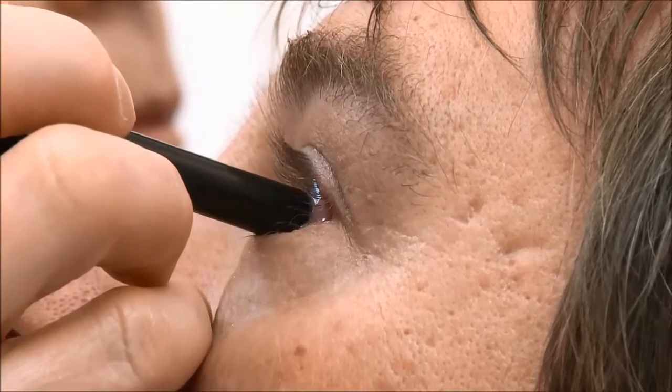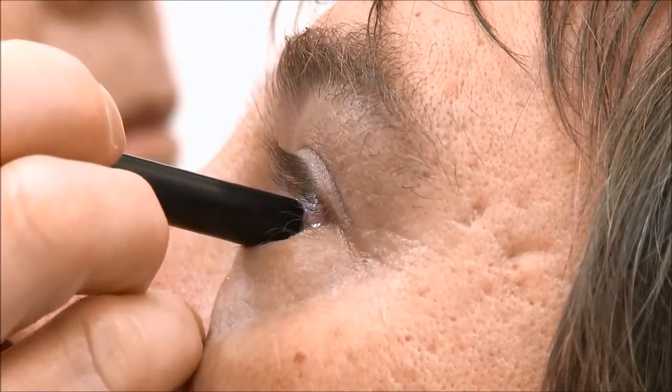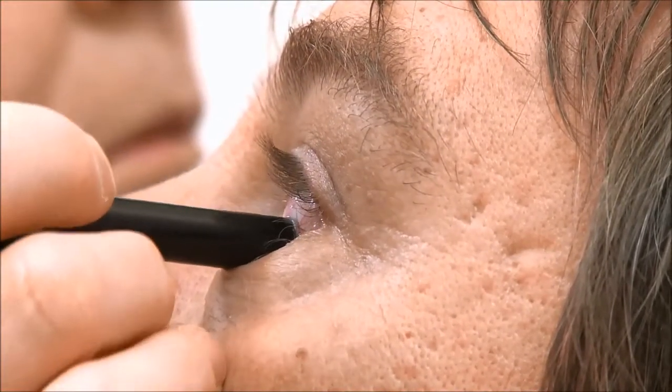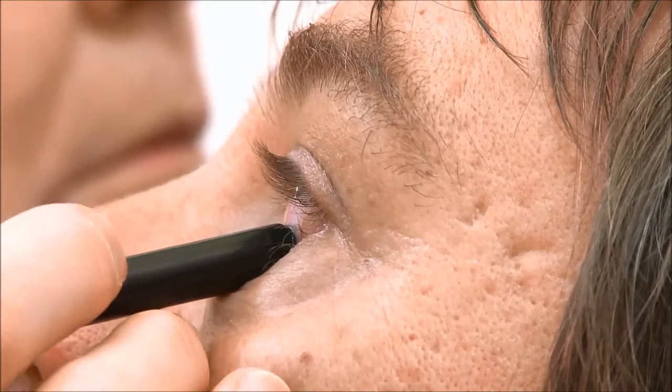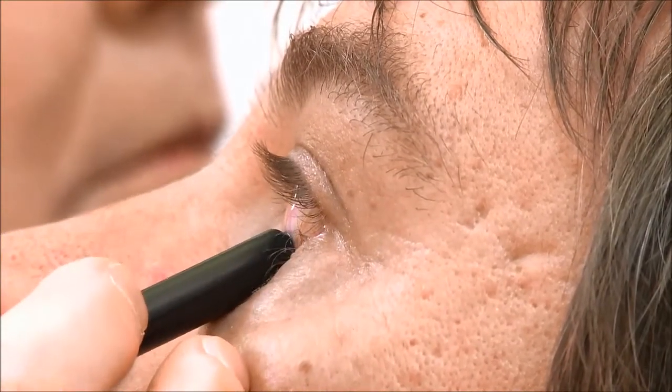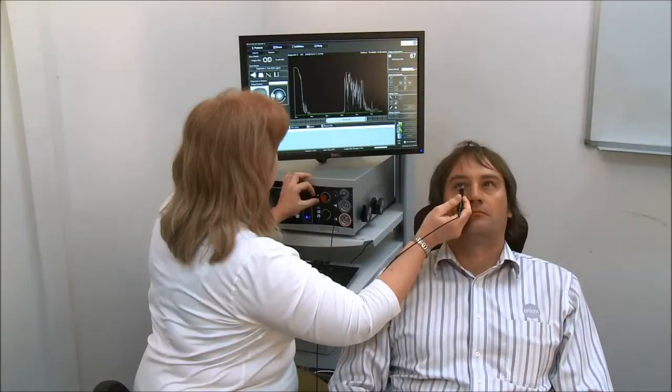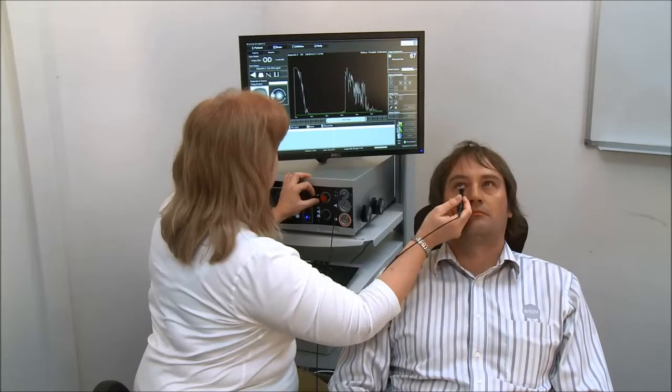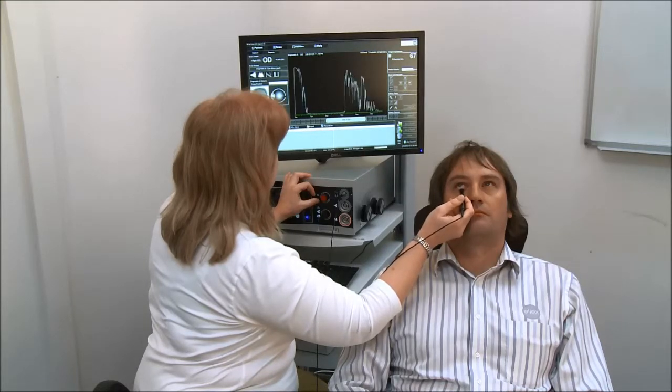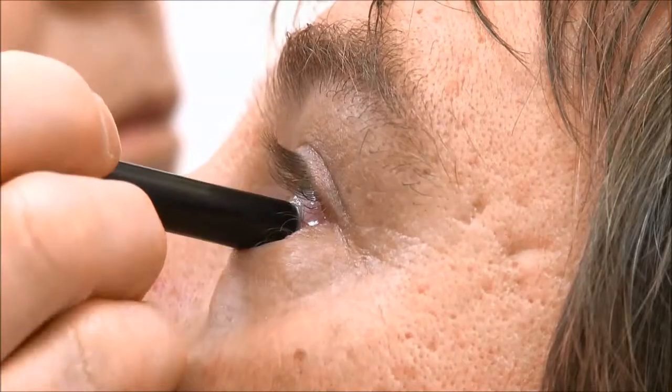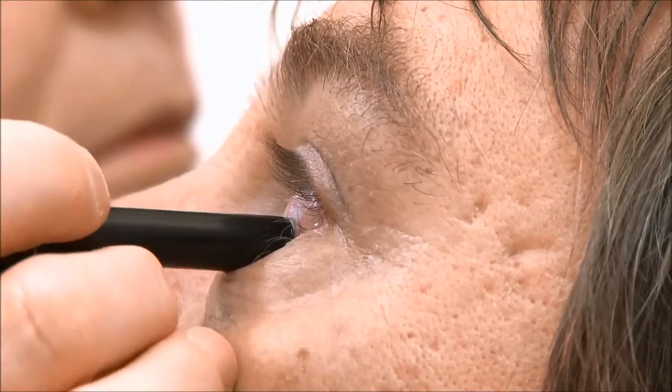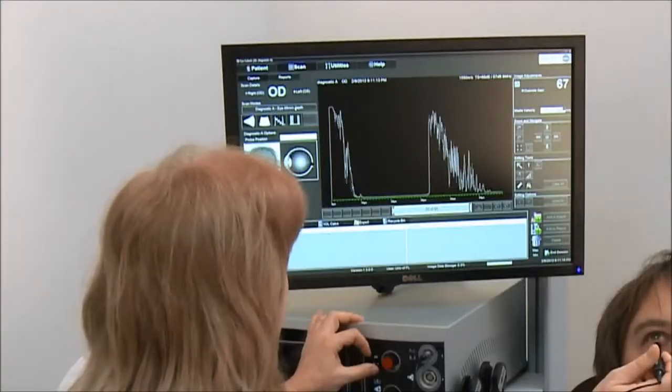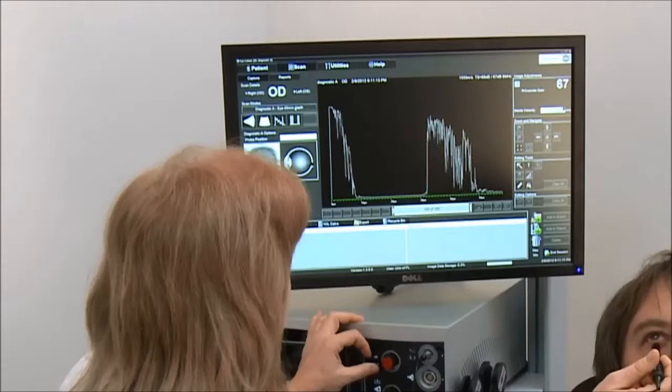The patient looks towards the area to be examined. If a lesion is noted superiorly, the patient looks up. The probe is placed at 6 opposite the lesion. By shifting the probe using micro-movements, the initial lesion spike is maximised and by evaluating the spikes between the initial spike and the scleral orbital spikes, the diagnostic information is obtained.